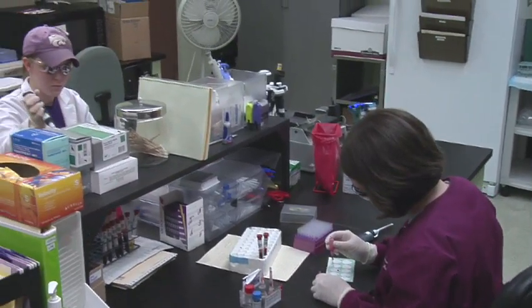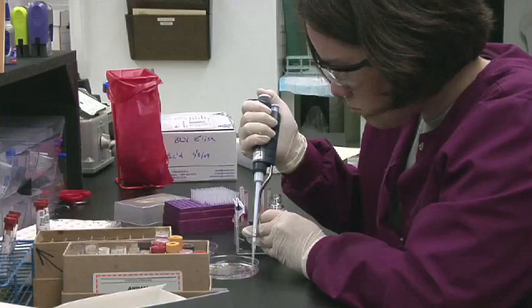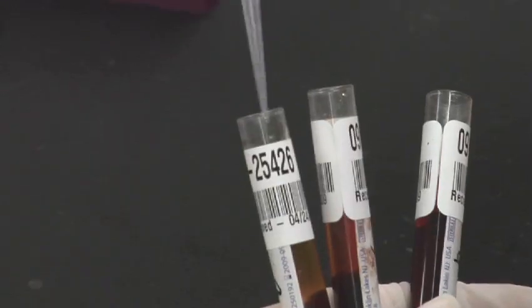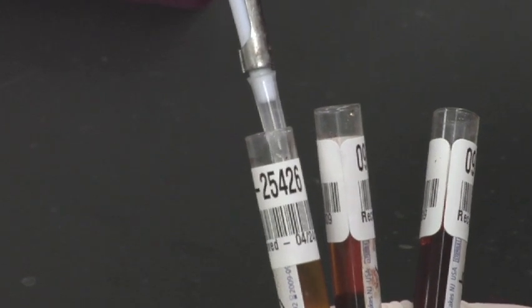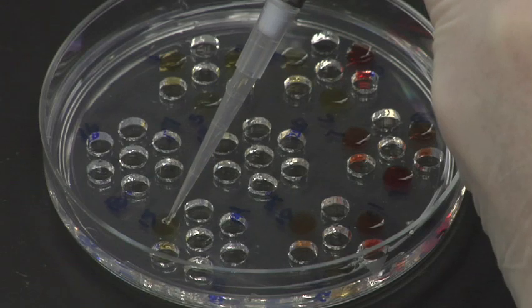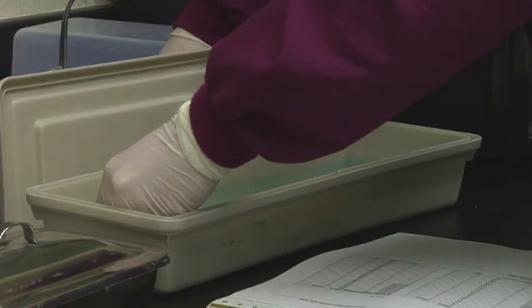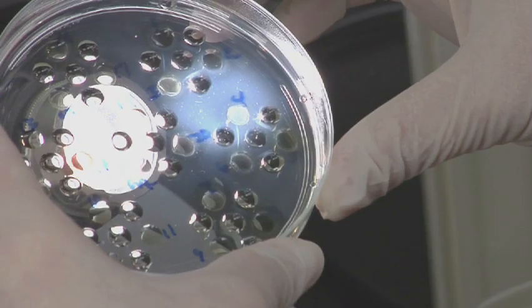Clients preparing animals for travel may turn to the expertise of the Serology Lab. This lab's specialized tests include the Coggins test for equine infectious anemia and a new AGID test for avian influenza. Additional analyses screen for bovine leukemia, blue tongue, caprine arthritis, encephalitis, and leptospirosis.